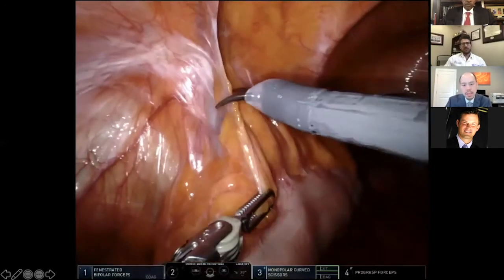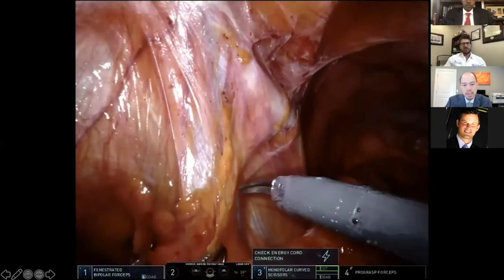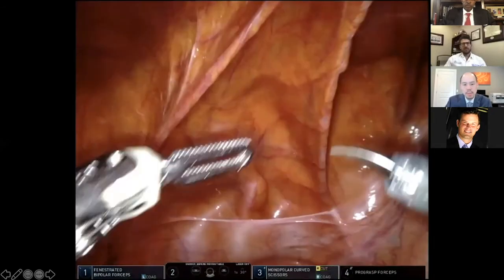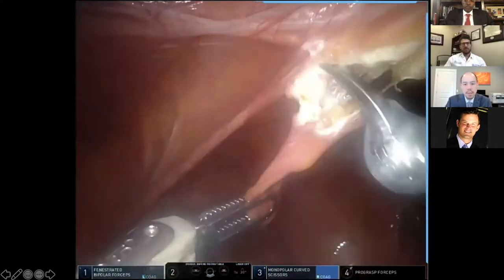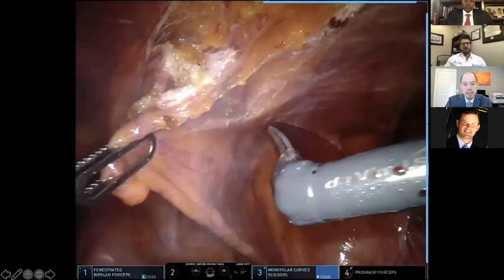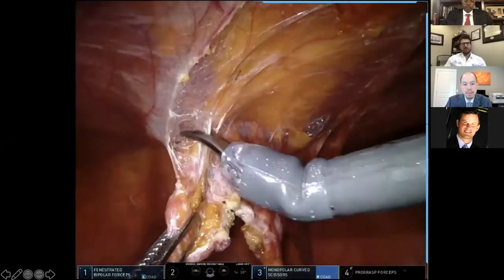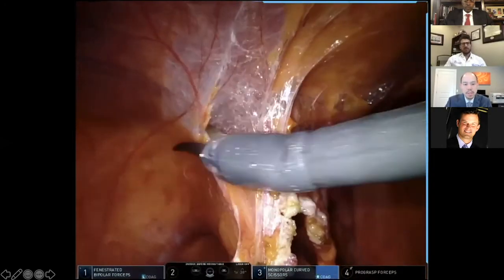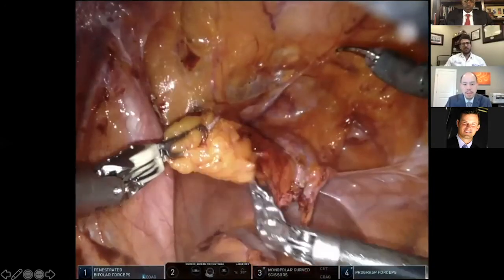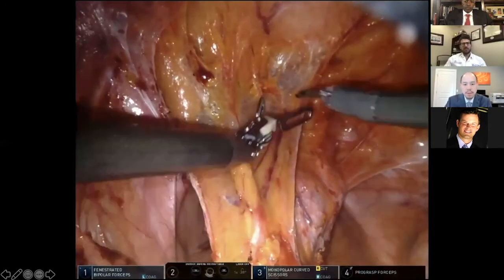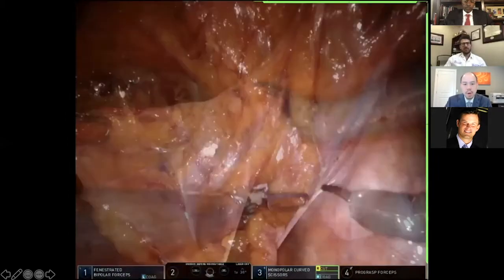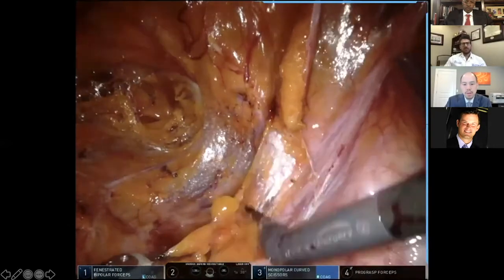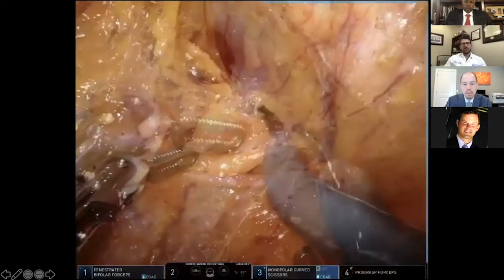This is a transperitoneal approach with a standard patient without much adhesions. We usually start by mobilizing the sigmoid in the left pelvis. We'll identify the medial umbilical ligaments and then divide the urachus. We're dissecting along the sides of the umbilical ligaments, then mobilizing anteriorly, separating the bladder from the anterior abdominal wall. The fourth arm is used for retraction, and this is the border for our lateral dissection down to where the vas crosses underneath the medial umbilical ligaments.